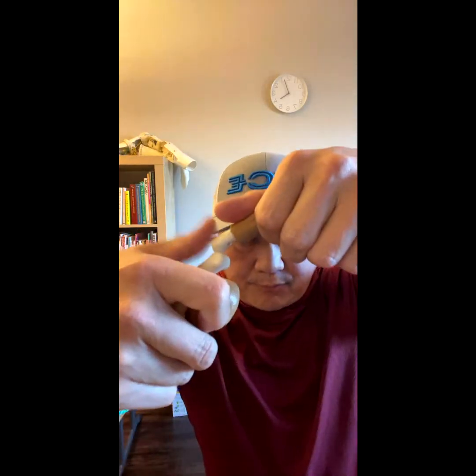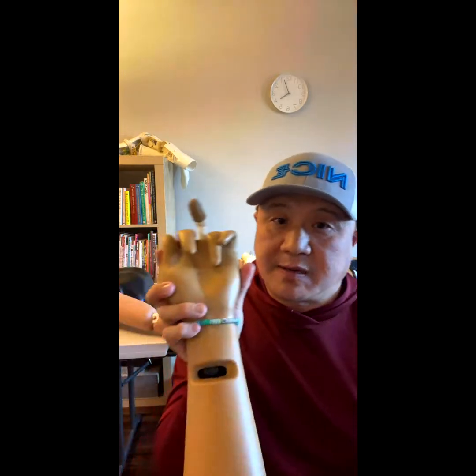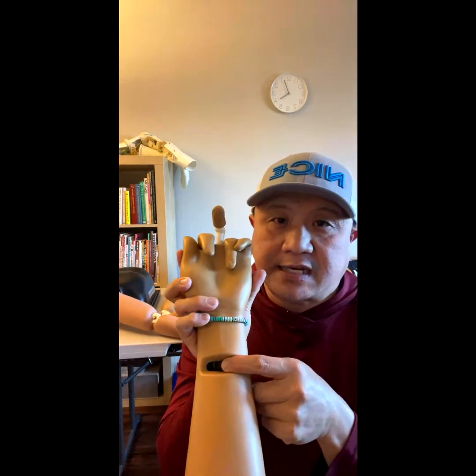So if this happened, you have to put it back, fix it, reduce it. Push and pull — the extension snaps. You can do that as many as you want, and the tension is adjustable.